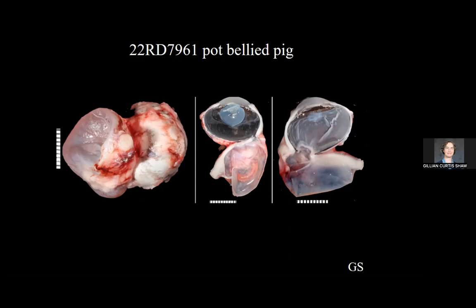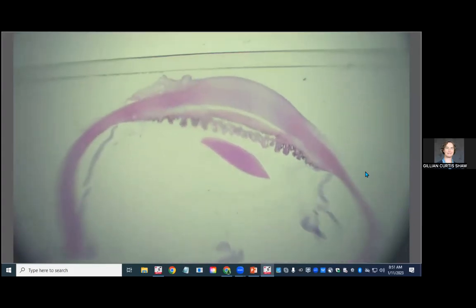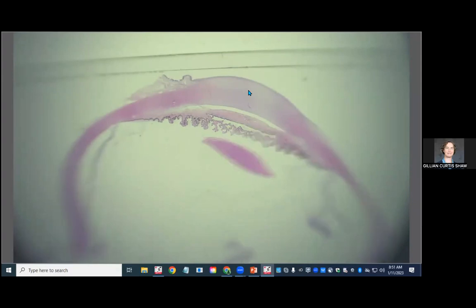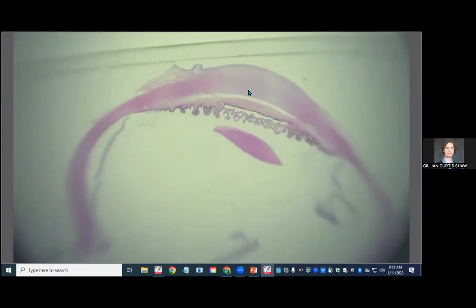Okay, and I have to switch over to the thing. Okay. So this is a peripheral section, and we know that because we don't have the pupil and we have the little ciliary body plicae spanning across the posterior chamber there. The corneal segment that we're looking at is also quite short. So this is just a peripheral section, but it's also the one that displayed this lesion the best.